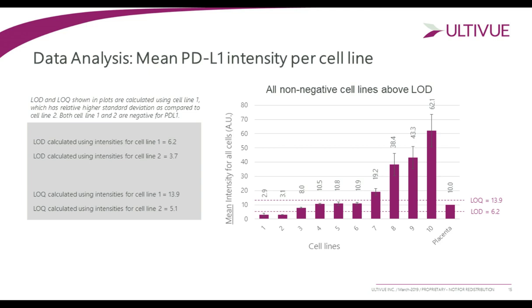So having an assay that is verging on the levels of quantification, by being able to set some standard curves using types of controls like this, allows you to understand the lower limits of detection and how much PD-L1 may be important for a specific treatment protocol. And that becomes more and more important as we develop more and more immunotherapies and these types of personalized medicines that we're seeing in recent years.